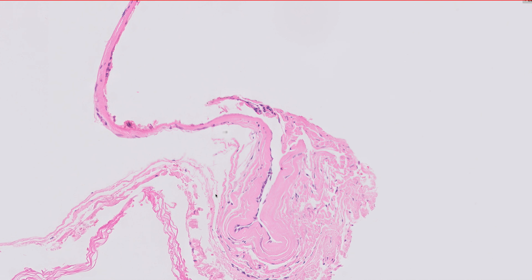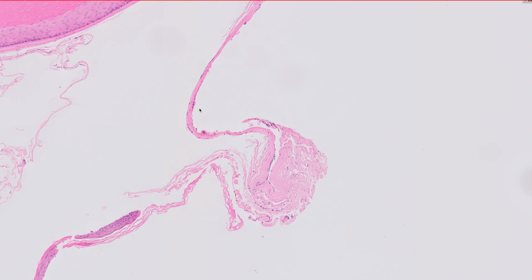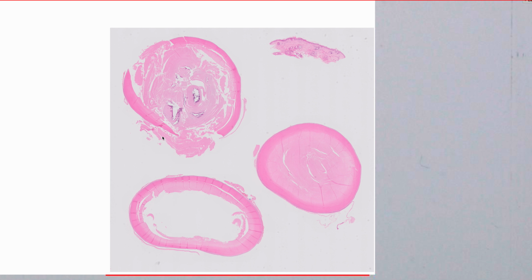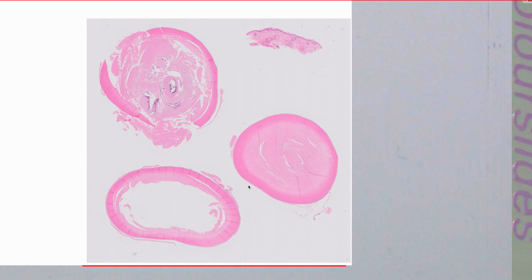And certainly I've seen cases where people have mistaken this for a separate or coexisting hydrocystoma of skin, when in fact it just merely represents the split outer wall of a pilar cyst. So just something to bear in mind, something that you often see in association with a pilar cyst, and not to be confused with a hydrocystoma. So this was a nice example of a pilar cyst of skin showing some calcification and splitting of the cyst wall.